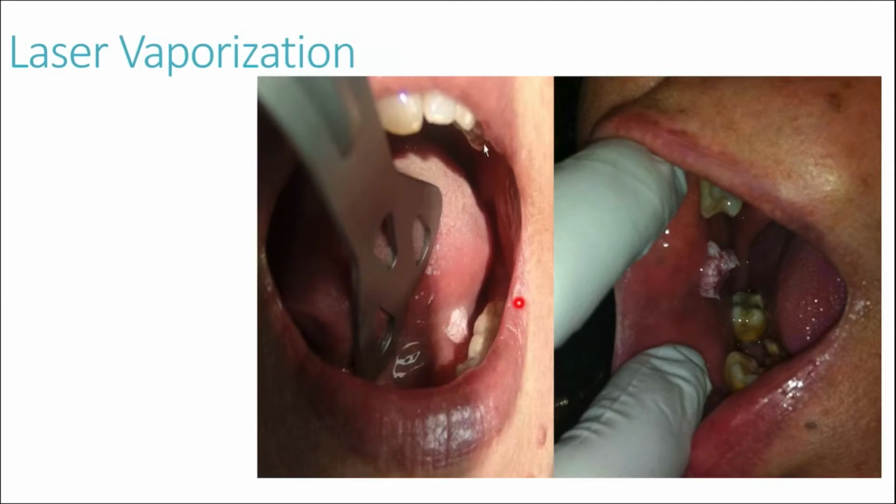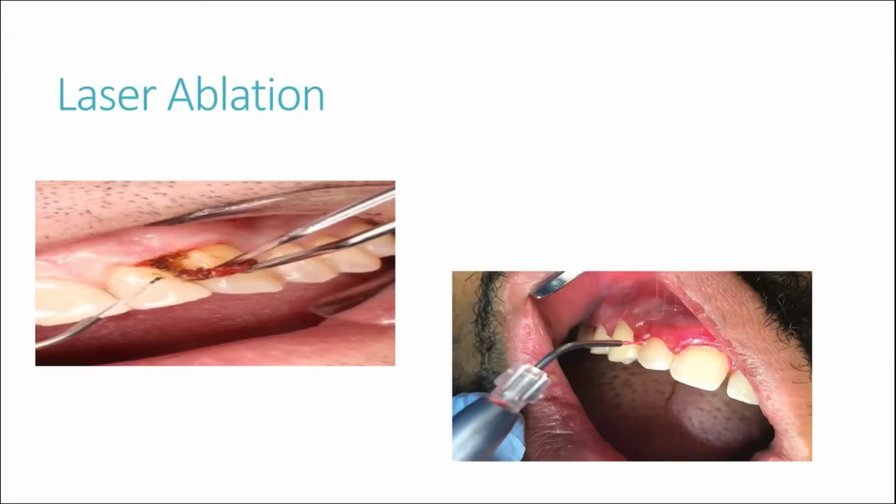It is used for the removal of large epithelial surface lesions. Use of a scalpel in this case would remove more than we want, so the best solution is the use of the laser for removal, as the epithelium is very superficial, like in oral papillomatosis. Laser ablation is used for gingival contouring, management of hyperplastic lesion, hyperkeratosis, and stomatitis nicotina. Conservative treatment provides the possibility of removing cell layers selectively from the superficial surface.